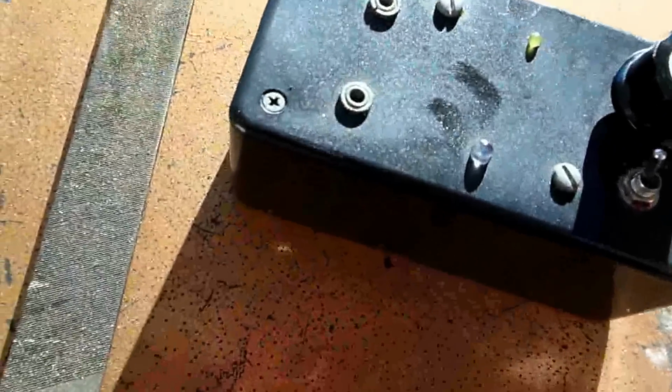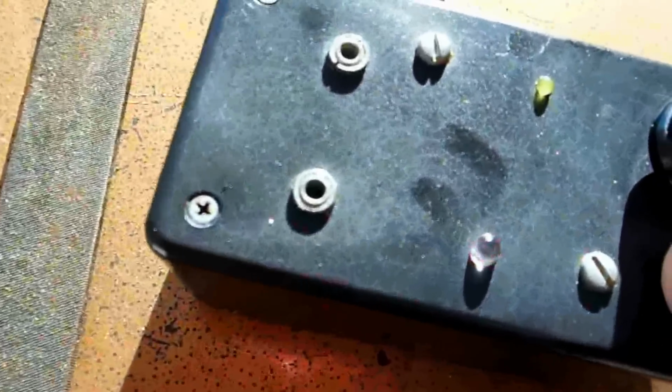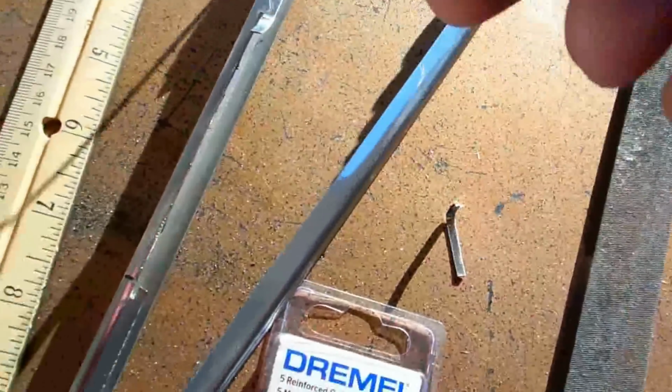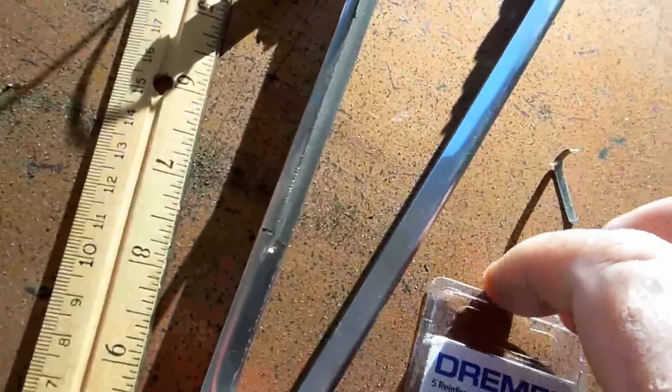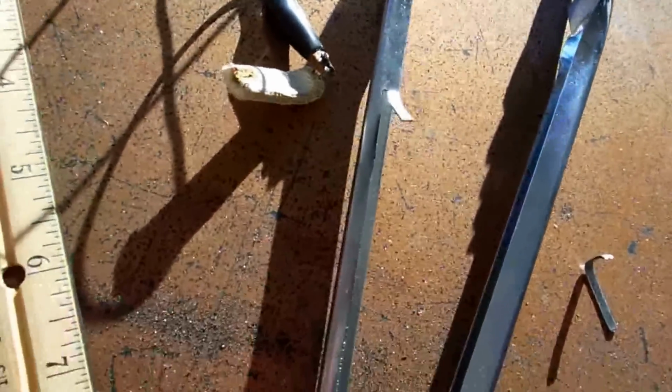And this is a little blood electrification device. You can see when you turn it on, you can't see it too much out in the sun, but it's flashing back and forth, red and green. And instead of just using these cloth strips, Dr. Beck, PhD, he said to use these little metal things surrounded by cloth, and I made them.